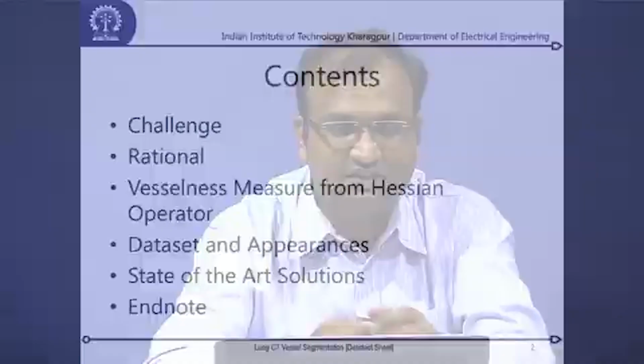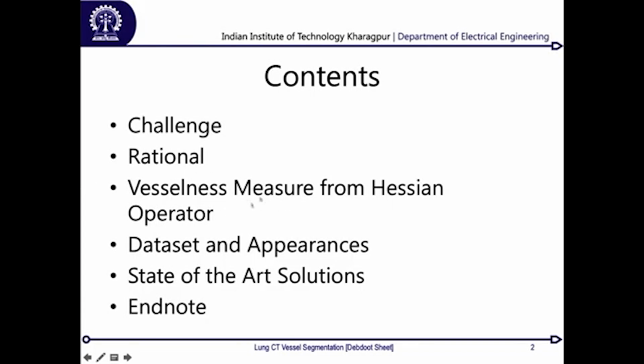This paper dates back to the early 1990s, and at that point of time there weren't any machine learning based techniques as we know today for segmentation of 3D objects. But we did figure out a way of using Hessian based operators and then finding principal component analysis and the principal component vectors in order to figure out a vesselness response. That was one major prior art contribution and one of the strongest standing points from the perspective of vessel segmentation.